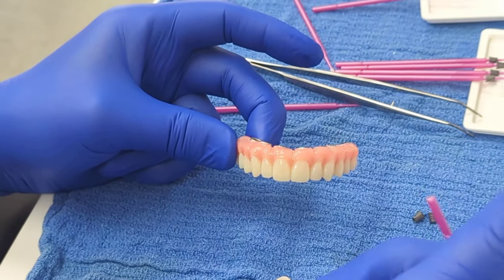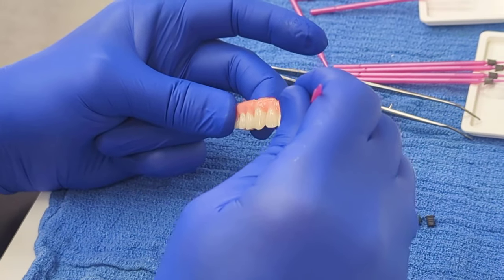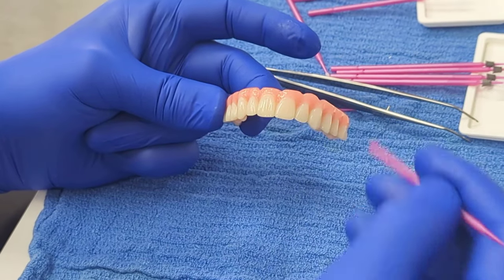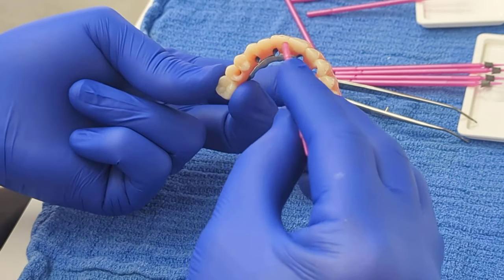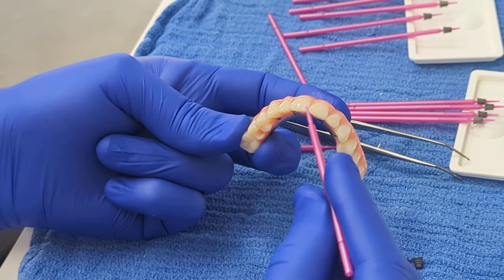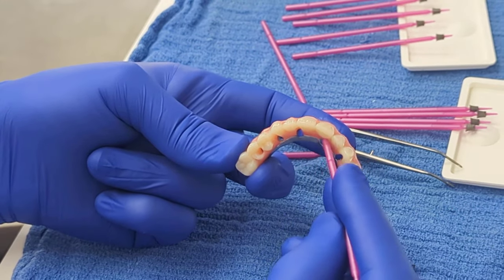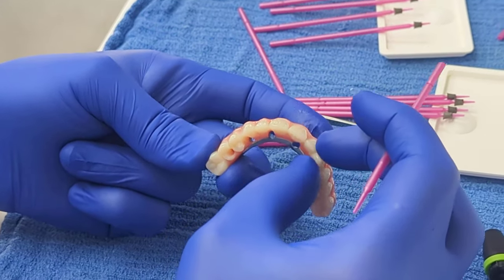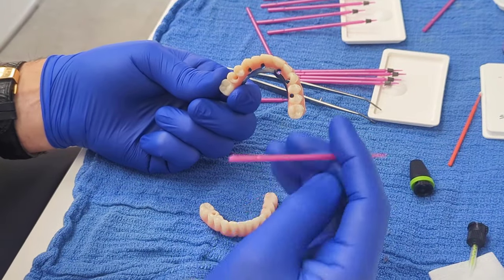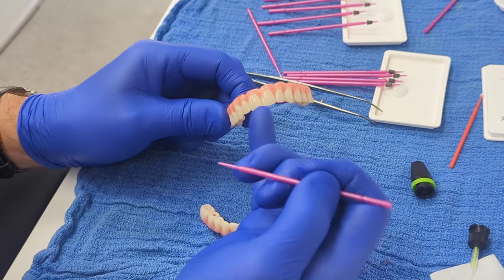And lastly, we've talked about at least 6 or 7 advantages of the Gen 4. There is one disadvantage, and that is these teeth are not as strong as zirconia. And in particular, she's never gonna chip these teeth or wear these teeth except on the incisal edges. So in essence, there are 6 upper incisal edges that thin out, and these thinner areas are the only area that could possibly chip. You're never gonna chip something back here.